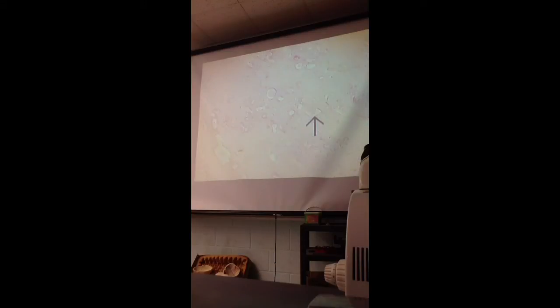Again, you can see fewer glands but more stroma, right? Because there is not much production of the semen. You have fewer glands but more stroma in older people. That's also a big risk factor for prostatic hypertrophy or prostate cancer. That's the third most common cancer in males.